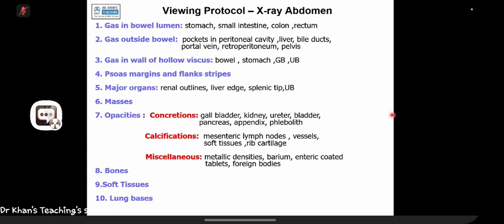What we learned in this session were features of small bowel obstruction and large bowel obstruction. I told you a few exam favorites: sigmoid volvulus, cecal volvulus, how to differentiate them, and toxic megacolon, the favorite of favorites, right? So thank you very much.